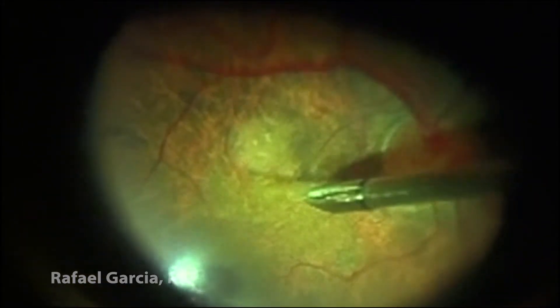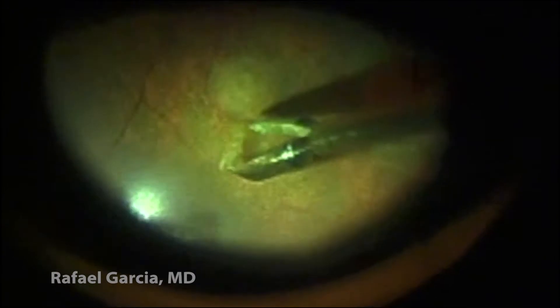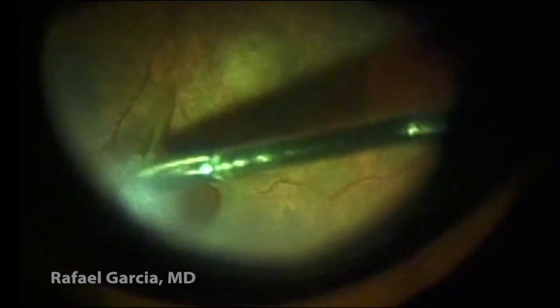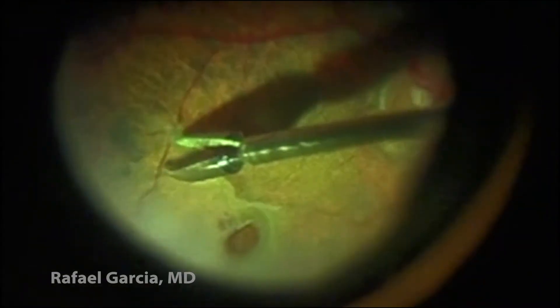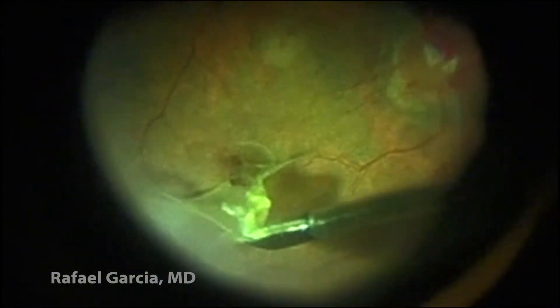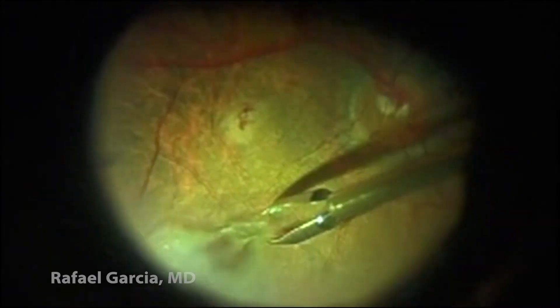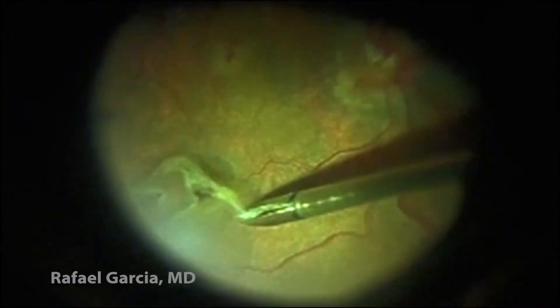We start the peeling by making a pinch on the epiretinal membrane to create a flap. Next, we grab this flap and proceed with the peeling in a circumferential fashion. We're using a 23-gauge asymmetric retinal forceps, specially designed for this purpose. Multiple grasps are commonly necessary in this part of the surgery.